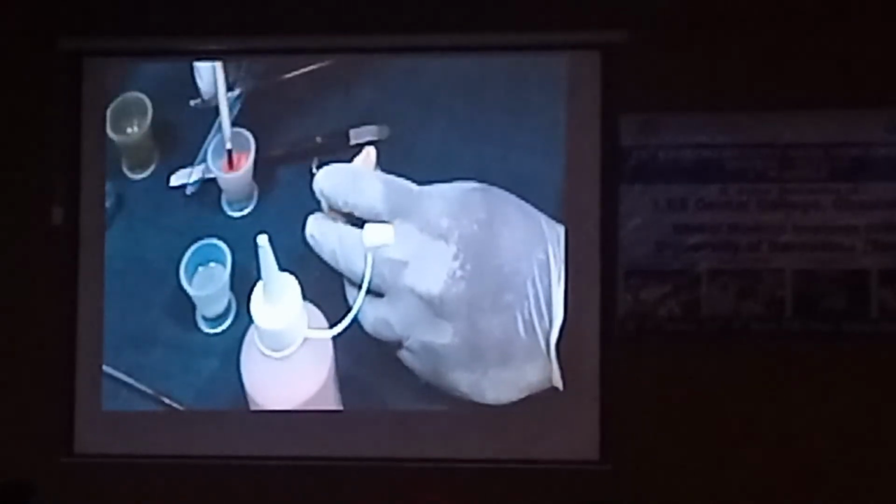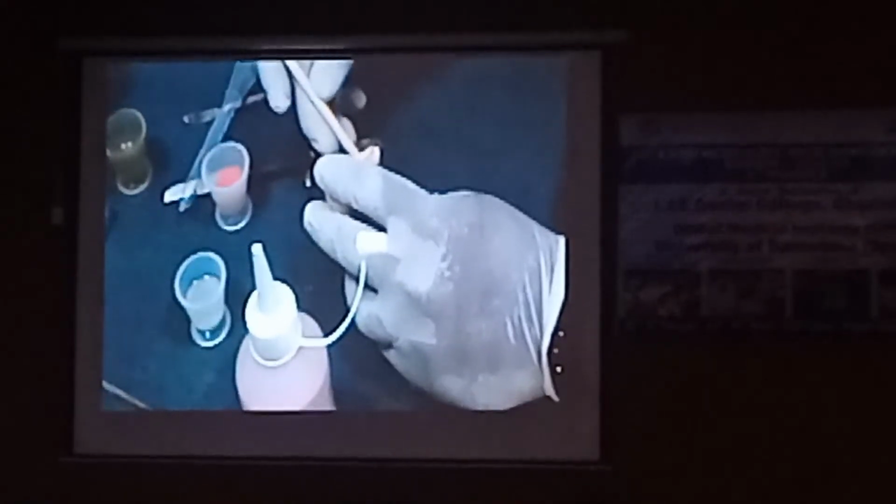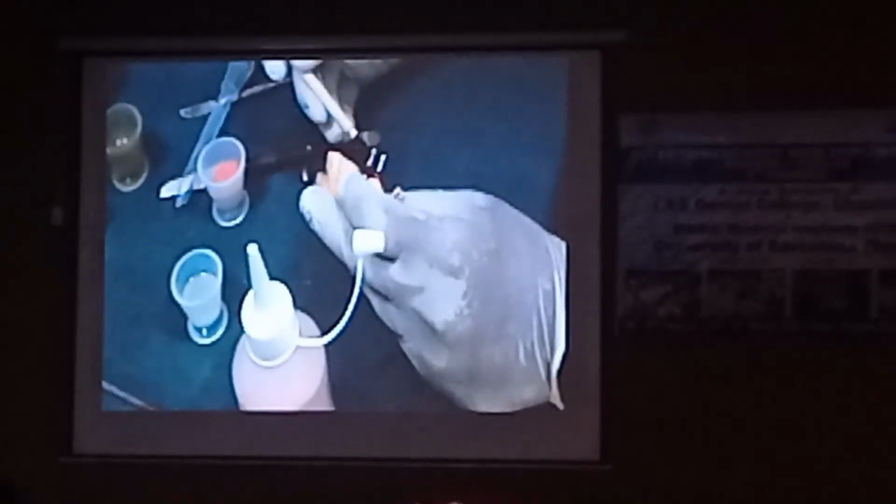See, as I told you, the jig has to be 360 degree, right? So this we were not able to do yesterday in the patient's mouth.